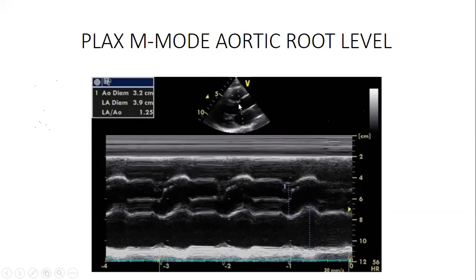And then this is the aortic root. This is the left atrium. And if this is the left atrium, here, this is the mitral valves. This is the left ventricle. And then this is the left ventricle outflow tract. Blood is going up there in longitudinal, parasternal long axis. So what you are seeing here now is that we've depicted whatever is there into this.